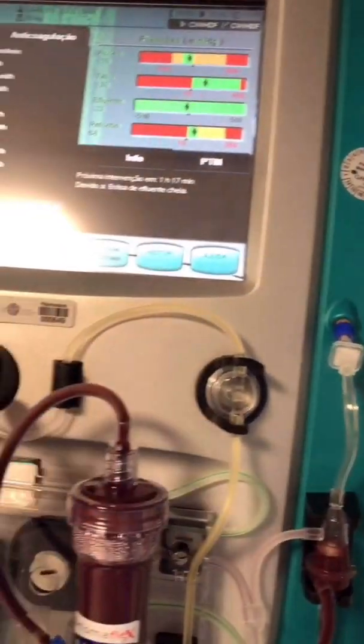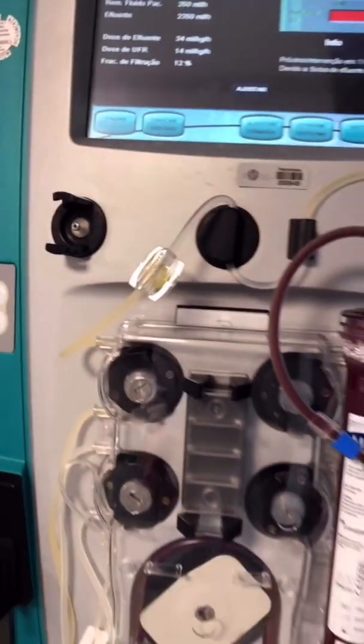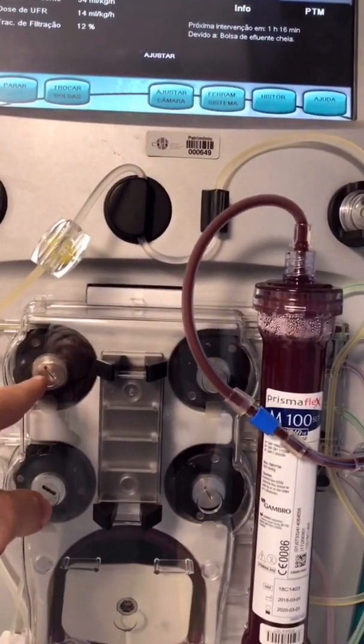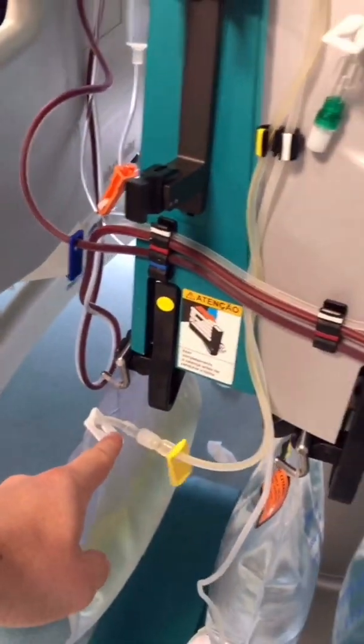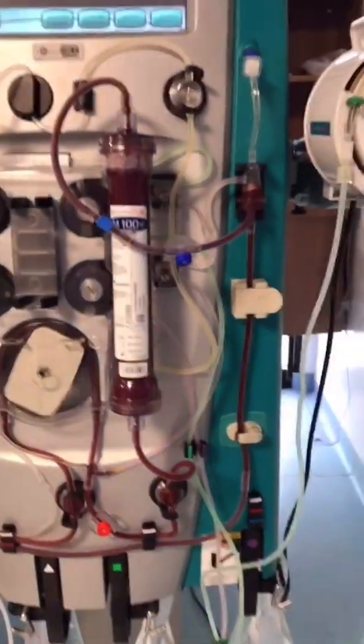The fluid exits the filter and goes to the effluent line, which is the yellow one. This is the pressure pod, then it goes down to the effluent pump — the one that runs faster because all the effluent is coming from here.